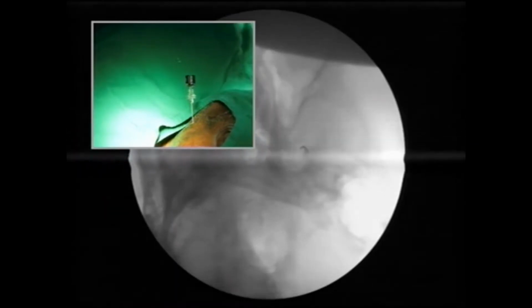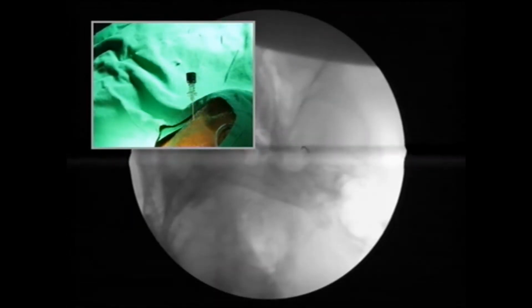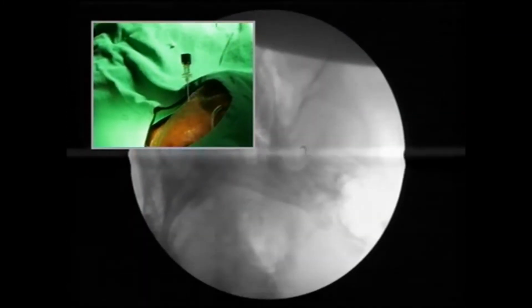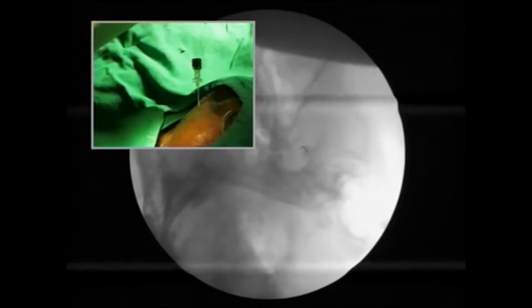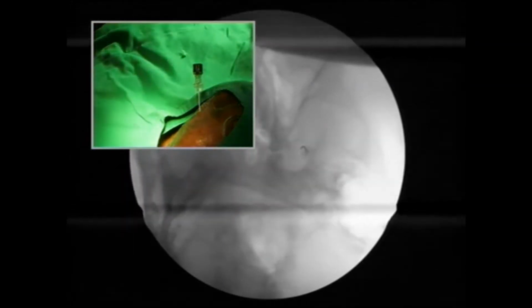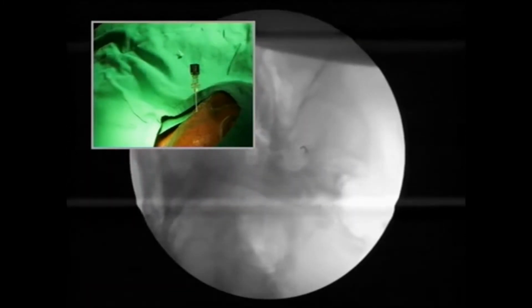I don't want to come to lateral at this time. Can you save this image and come to lateral? Relax. So now I'm shifting from the AP to the submental to the lateral view. In the lateral view, I want to be just past the zygomatic arch. Once I feel I am in the Meckel's cave itself, I'll do the stimulation and then I'll do the RF ablation. Probably will not wait for the RF ablation. Once I do the stimulation, you can shift over to the next case.